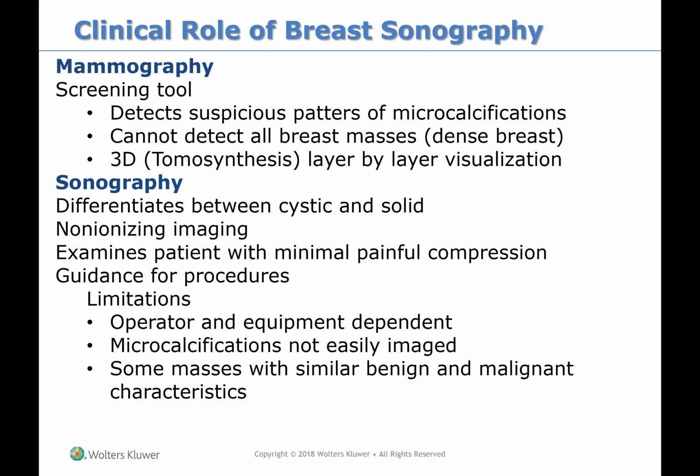I think a lot of us are a little bit familiar with mammography and its role in imaging the breast. Usually after 40 years of age, they like you to do an annual mammo to detect any kind of cancer or suspicion or anything like that.